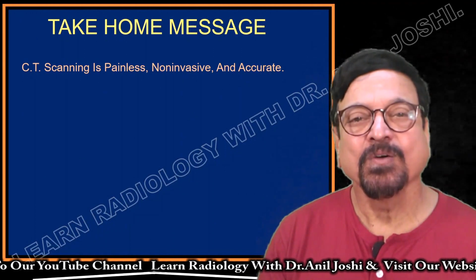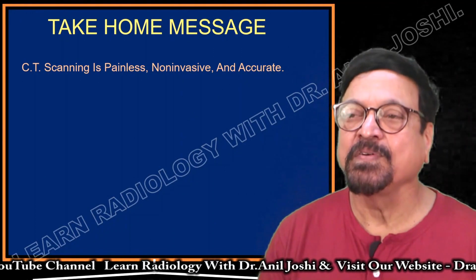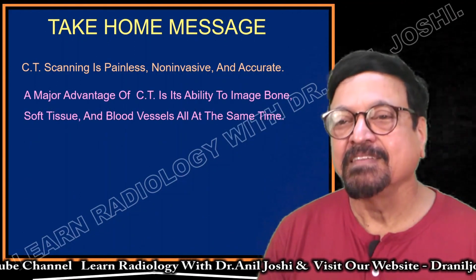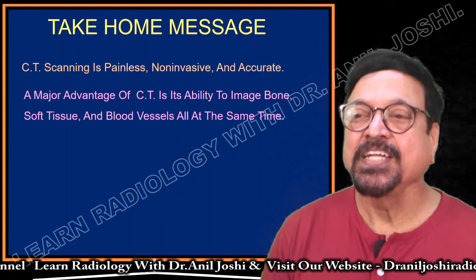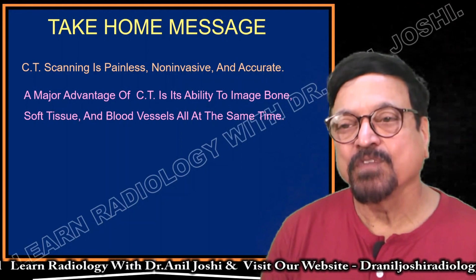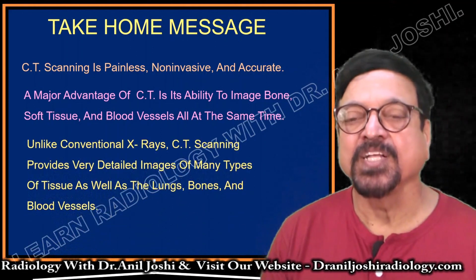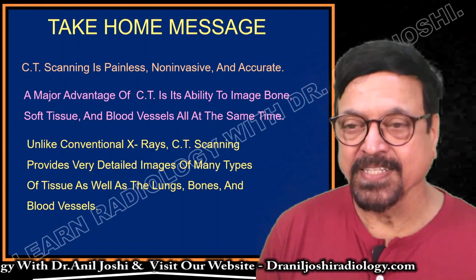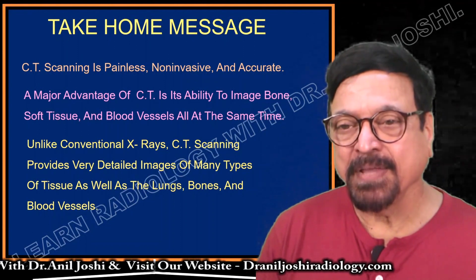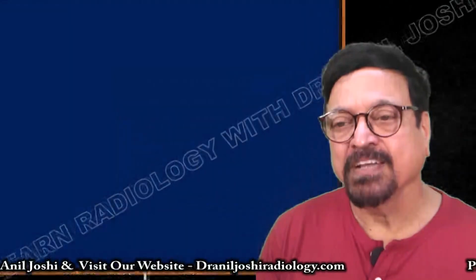Now what is the take home message? CT scanning is a painless, non-invasive, accurate investigation. A major advantage of CT is its ability to image bone, soft tissues and blood vessels at the same time. These are the same as those of the routine CT scanner. Unlike conventional X-rays, CT scanning provides very detailed images of many tissues as well as lungs, bones and blood vessels.